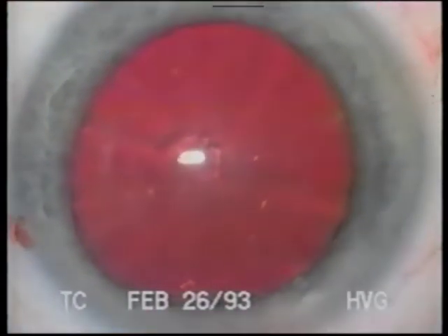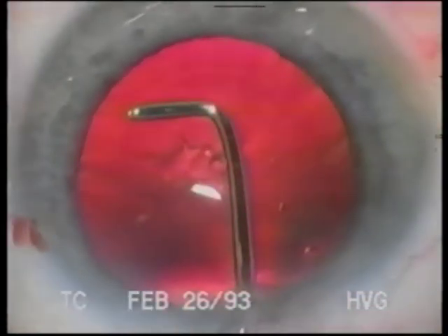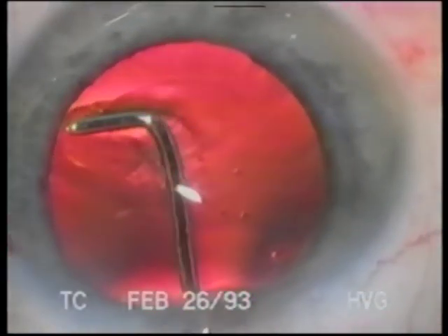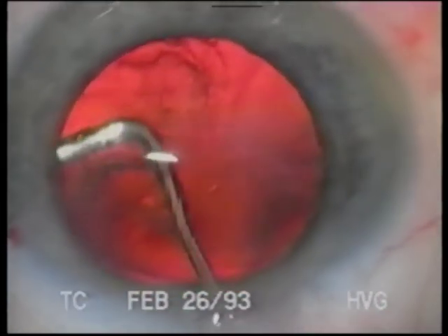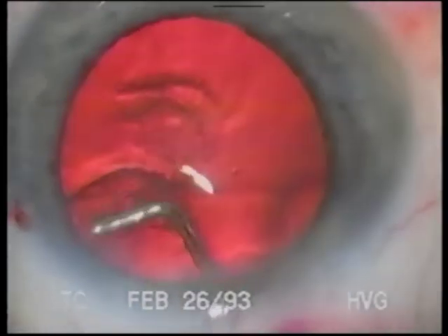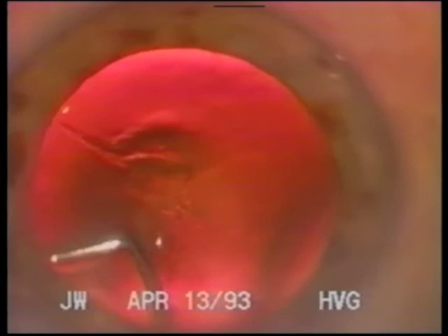In order to better facilitate cortical cleanup, I'm using a bent cannula for hydrodissection to inject the first fluid wave in the superior position. Here I'm using a 90-degree, 26-gauge cannula in a tenting and sweeping motion of hydro-free dissection. Then hydrodissection is performed, sending the fluid wave posteriorly and anteriorly. It has been our experience that cortical cleaving hydrodissection creates the cleanest dissection in the quadrant of injection. Thus, hydrodissection starting in the superior area may eliminate cortical cleanup in this difficult-to-reach 12 o'clock area.